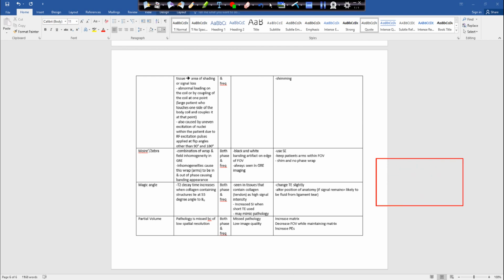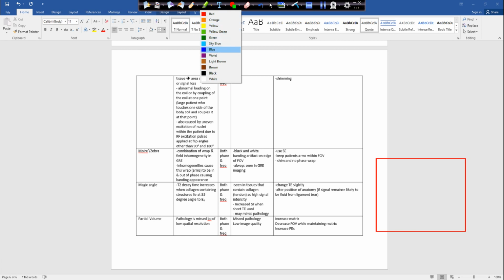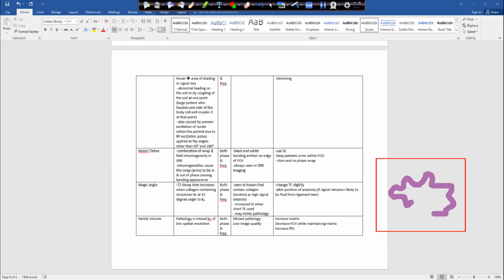So imagine we have a voxel this big. Okay? Pretty big voxel, not going to have very good image quality because our resolution is so bad. Imagine we had a pathology. That pathology is a tiny malignant lesion. It looks like this in the brain. So our brain is obviously huge compared to this tiny little voxel, and this was that little malignant lesion within the voxel.